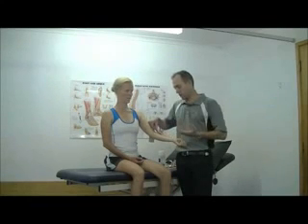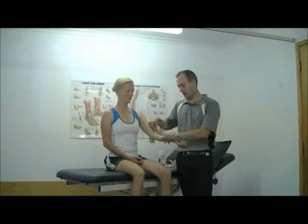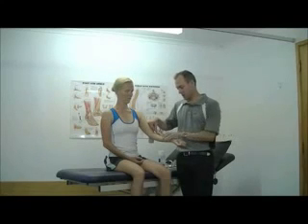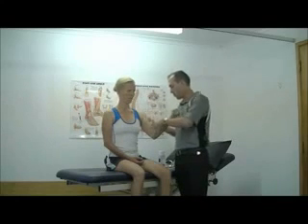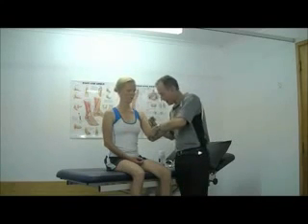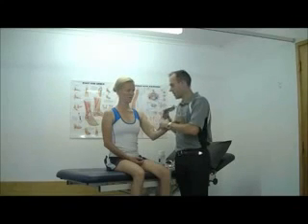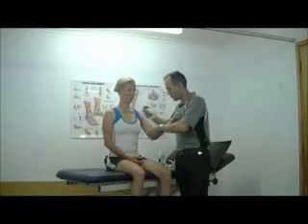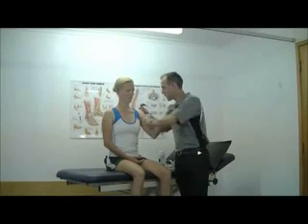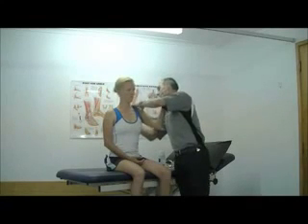As you become more familiar with the tape, you'll get a better feeling of how much stretch to apply, and you can then start to reduce the size of those anchor points as well. Okay, so apply it there. It's also important not to tension and then anchor along the length of the tape, or you will end up with these tension points along there. So it's important to try and get a smooth tension all the way along and smooth down as we go along. Okay, have them again, correct their position.